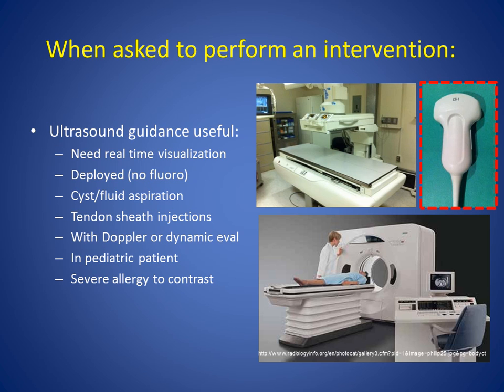If we're going to do cyst or fluid aspiration, tendon sheath injections, or if we're going to combine it with Doppler or dynamic evaluation, similar to what Dr. Fajardo talked about, ultrasound is going to be the modality of choice for those things. In a pediatric patient, we often default to ultrasound because of the lack of ionizing radiation and because we don't need sedation. And you can use it if you have a severe allergy to contrast.